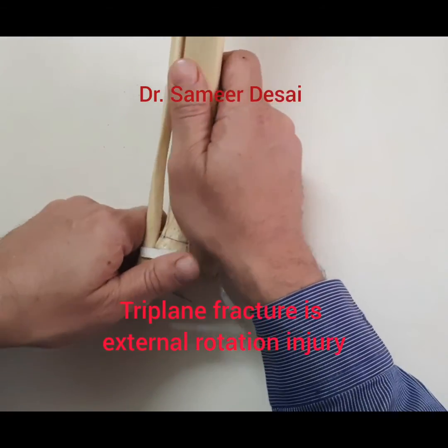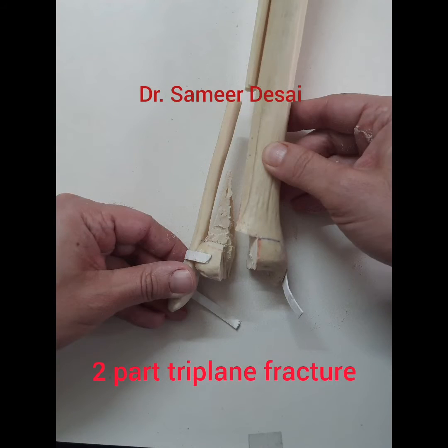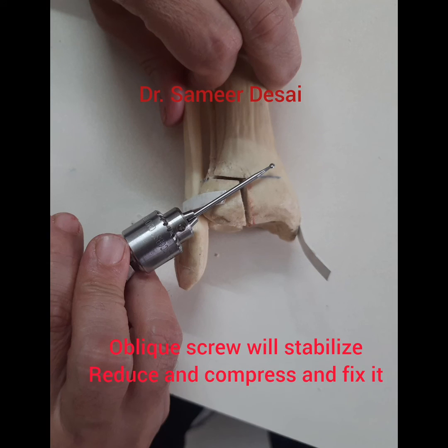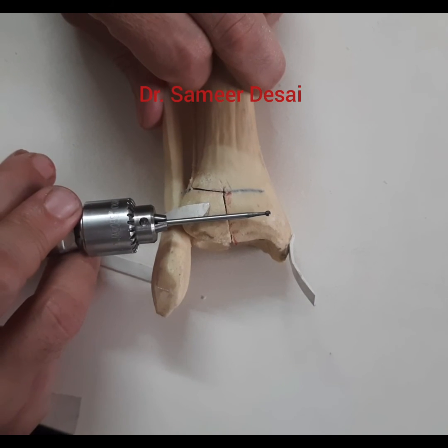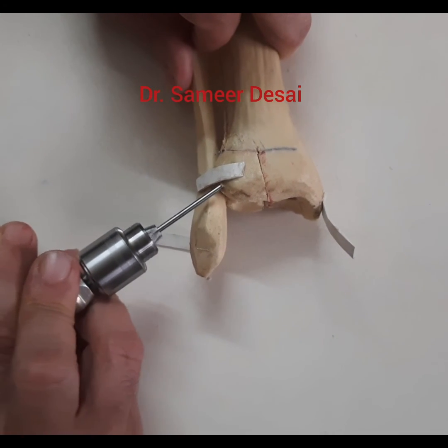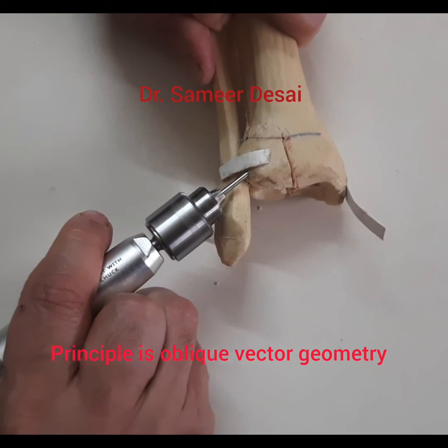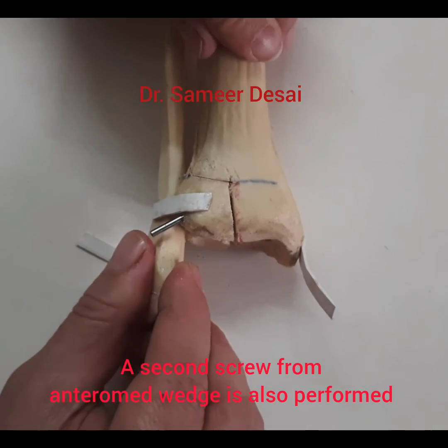A triplane fracture is basically an external rotation injury, and we have shown you how the two-part fracture happens. You can fix it either using a transverse screw, or the better option is an oblique screw which will stabilize, reduce, and compress the fracture. You may also have to pass a metaphyseal screw — and this construct is stable.